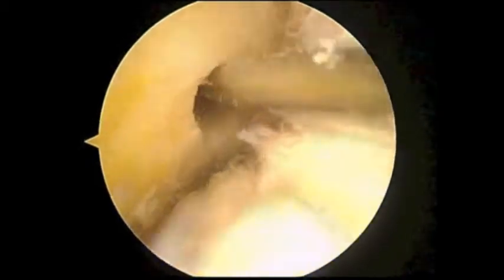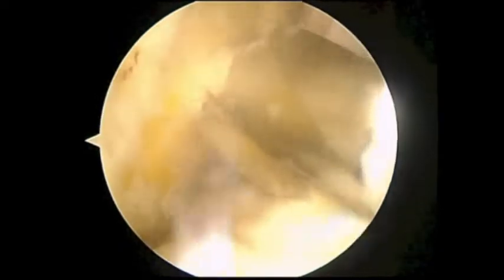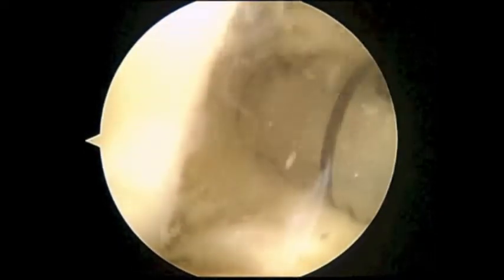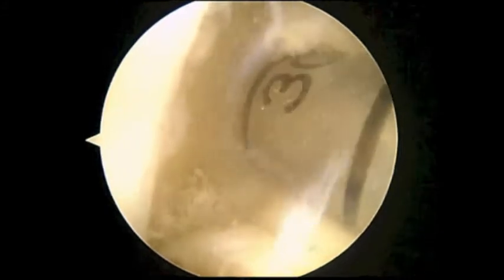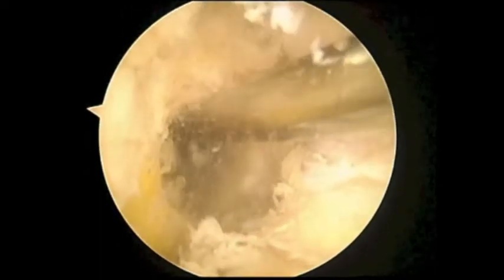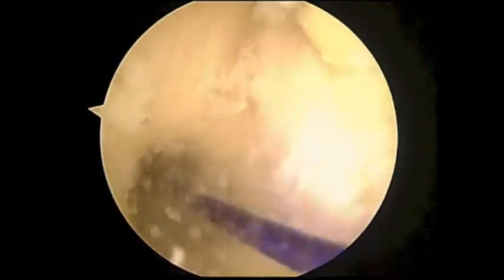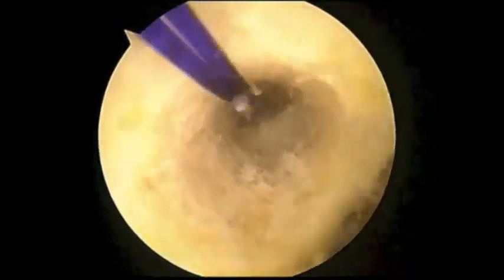Now we're going to drill over this guide pin using some cannulated drill bits. First we do a smaller drill hole. We do a slightly larger drill hole that's actually going to be sized appropriately according to the size of our graft. The graft that we use for this is hamstrings that are harvested from the back of the patient's knee. Here you can see the guide pin still remaining within the hole, with the hole being drilled over that. Now we'll pull a special suture through the tunnel and inspect the tunnel. Make sure there's been no breach of the wall in the back.